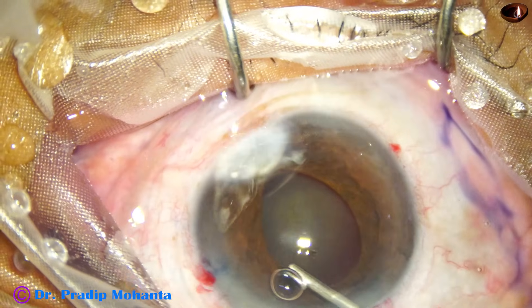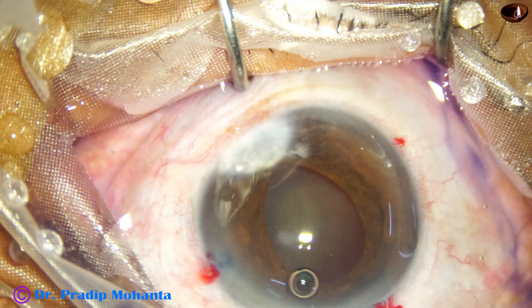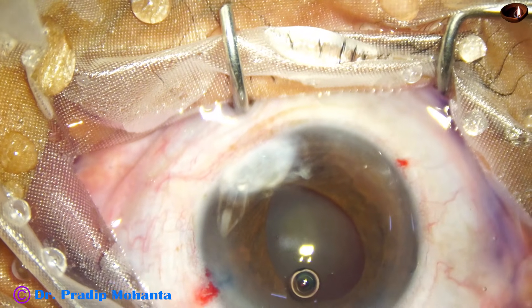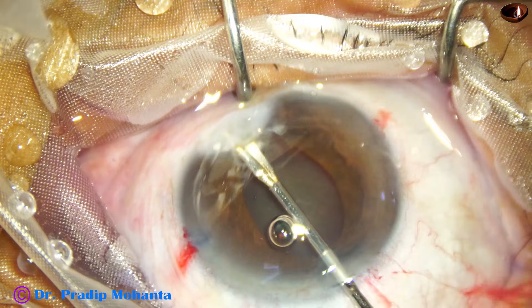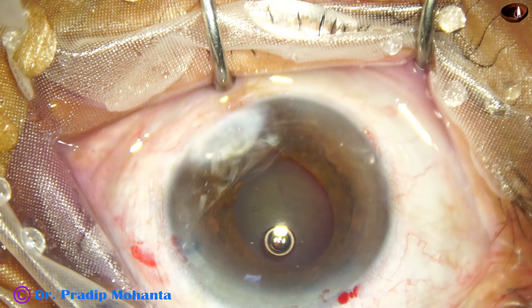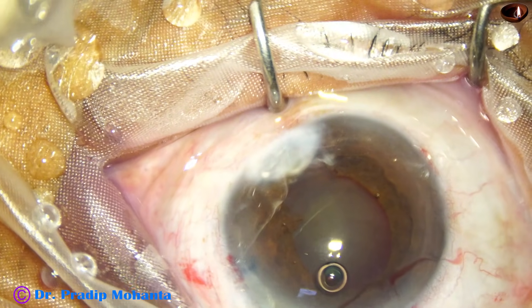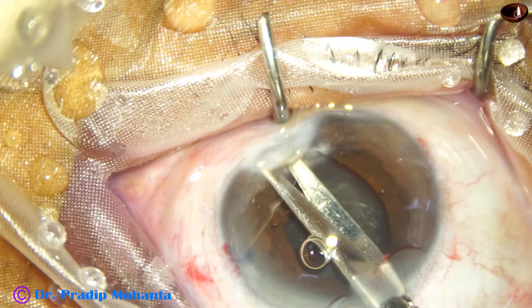This is HPMC filling the anterior chamber. Now I am taking scissors — first I take the micro scissor and am going to cut the iris. And now I find that there is still some attachment of the iris to the cornea.